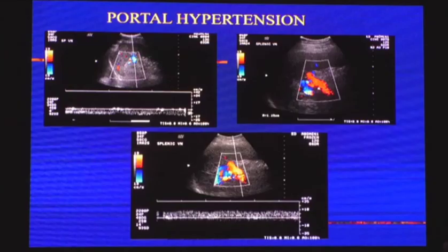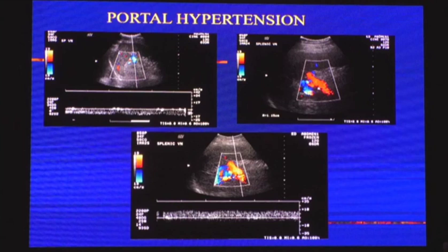In portal hypertension, the normal hepatopetal splenic vein flow — going away from spleen towards liver — is reversed. If we see red color where it should be blue, that is qualitative evidence of hepatofugal flow. Quantitatively, flow above the baseline indicates it is going towards the spleen rather than towards the liver, which is abnormal.